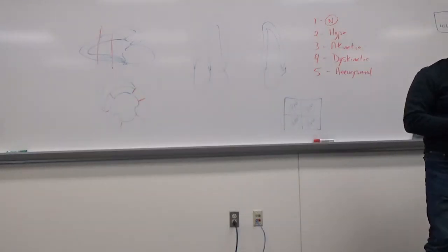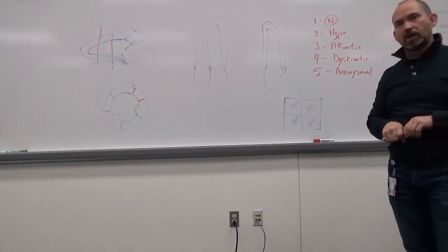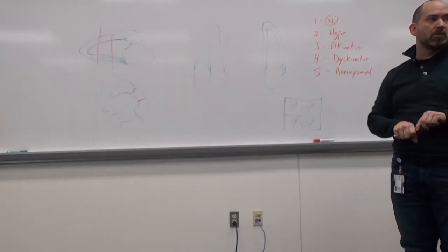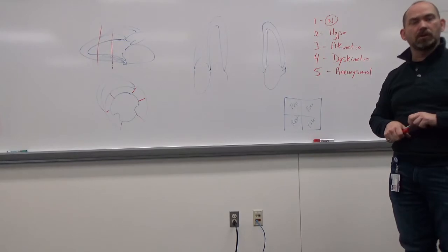The other thing that we are more commonly doing nowadays is diastolic type of stuff. So what do we know about diastole? What types of things are we looking at for diastolic evaluation?